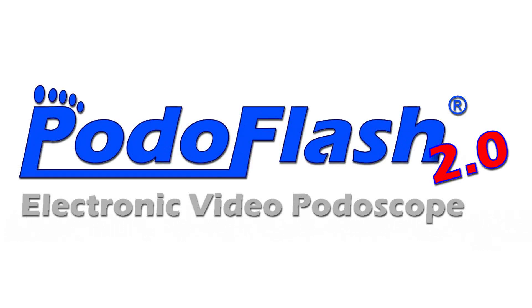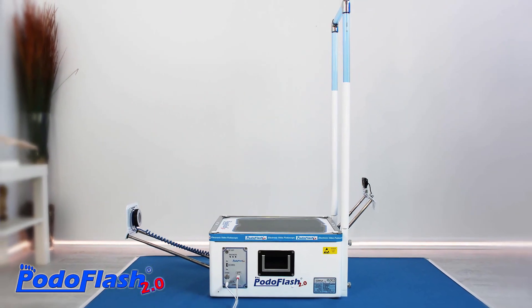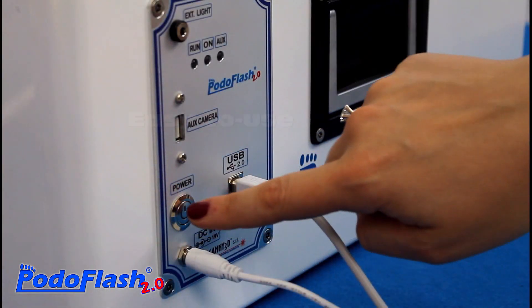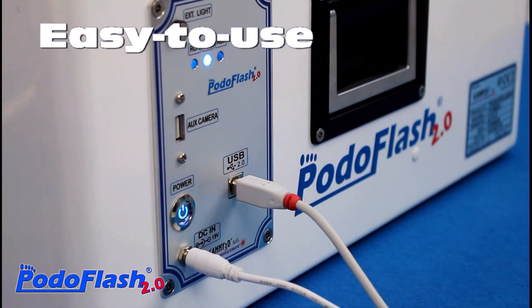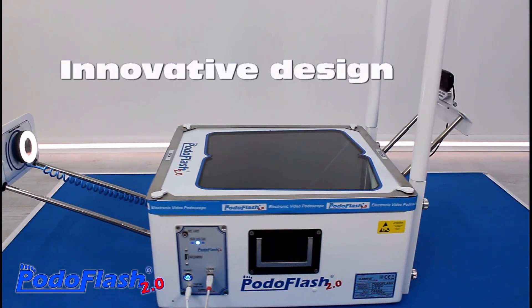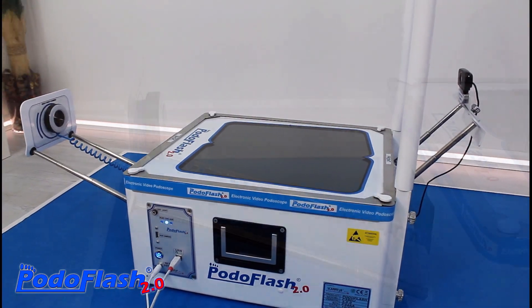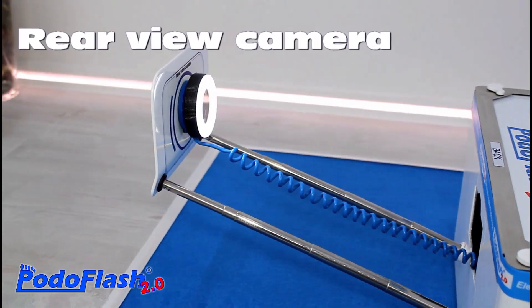Here we present the new version of Podoflash, the automatic electronic podoscope that Scani3D company has been producing for over 10 years. This new version is based on 3 high definition video cameras that allow to take photos and measure the foot from various angles.